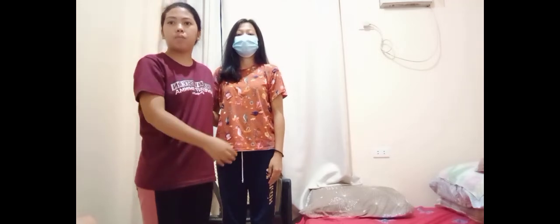We need to stand up. Can you put your hands on my shoulder, ma'am? On a count of three, we need to stand up. So 1, 2, 3. Next, stand in front of the person and ask them to sit tall, lean forward, and push down on the chair armrest as it helps them to stand.